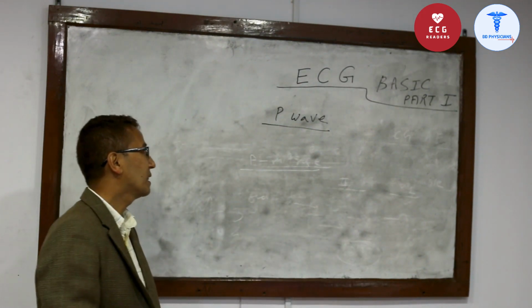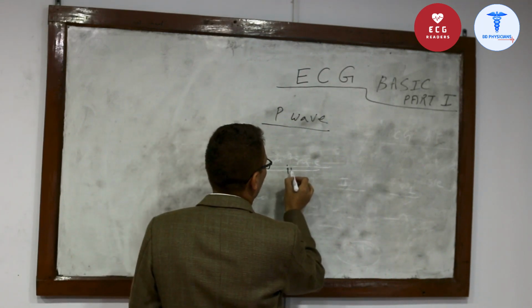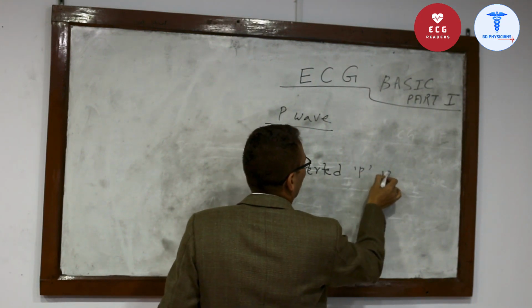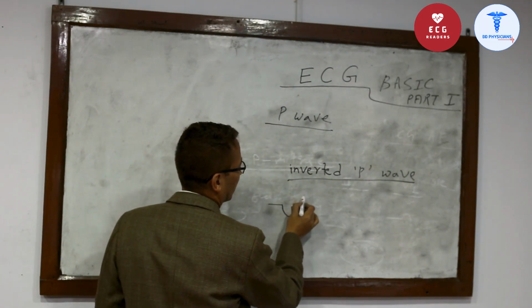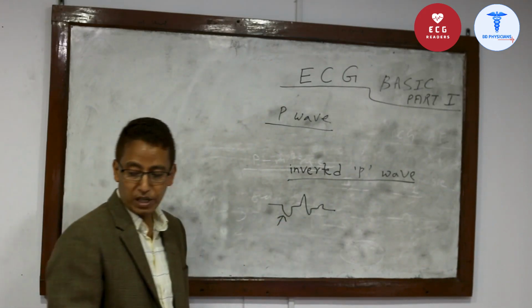Another abnormality of the P wave is the inverted P wave.